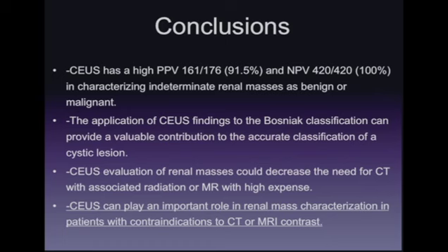I will note that based on our classification scheme, benign oncocytomas will be considered as malignant lesions, and in our institution, our urologists remove these. So actually, our positive predictive value was actually higher based on the way our urologists treat oncocytomas.